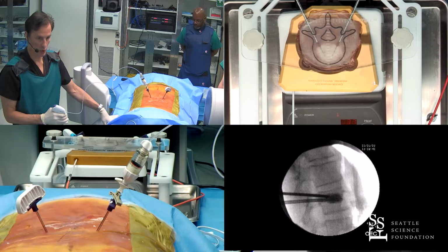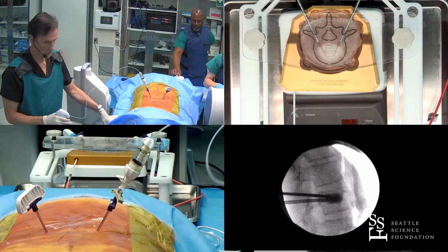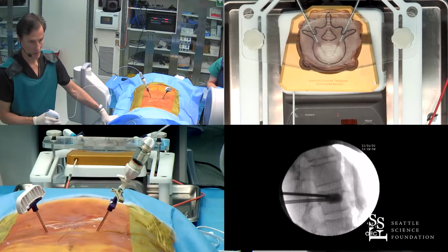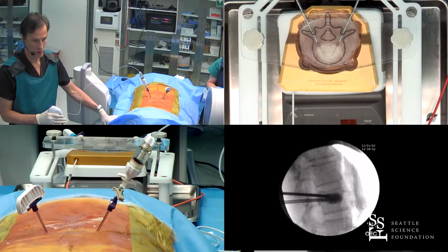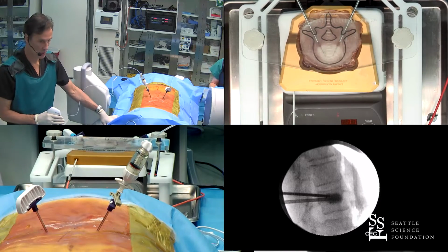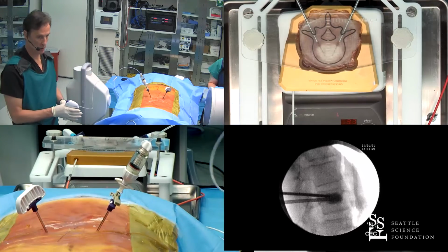That was a paper by Roeder. So, very nice. All right. Always inject in the lateral so you can watch for posterior migration. Okay, come back around to AP.